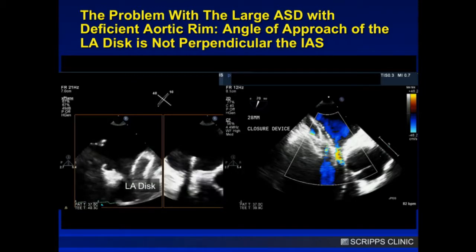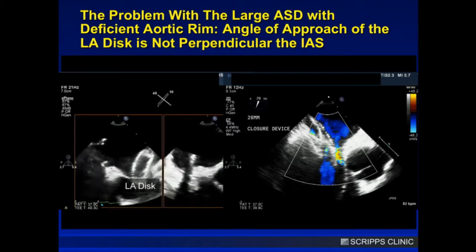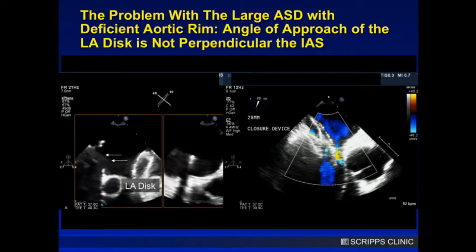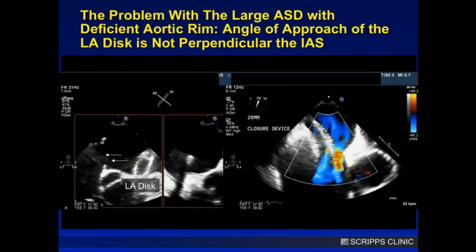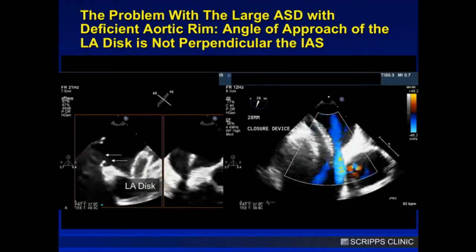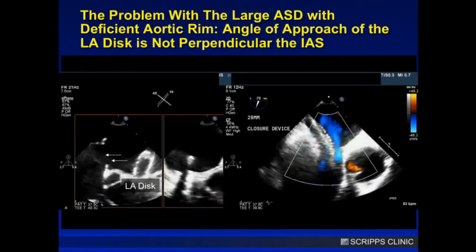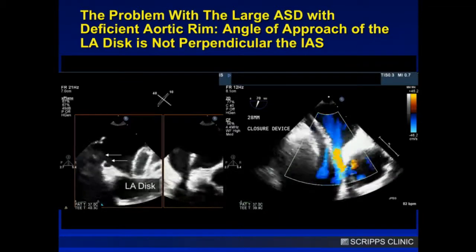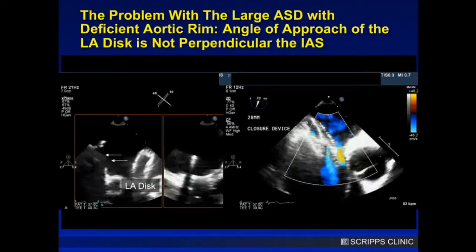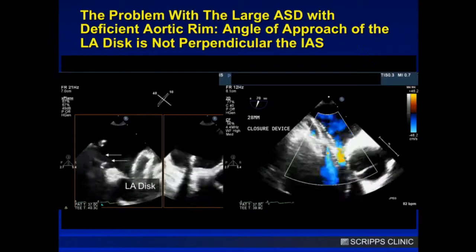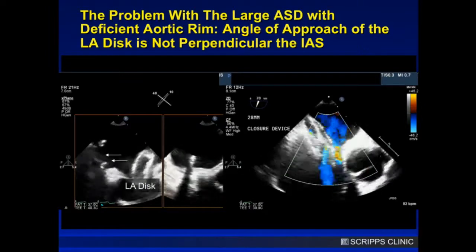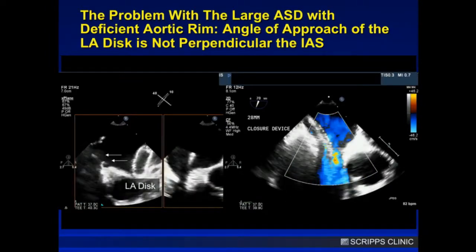The challenge from a technical, practical perspective is the angle of delivery of the discs in relationship to the inter-atrial septum. On the left panel you can see the arrows pointing towards the inter-atrial septum, with the left atrial disc open. As you pull that back, it will just slide through because the angles are not right — I'm parallel to the septum, not orthogonal to the septum. And you can see in the same case, as I pulled back and deployed the right disc, I've clearly fallen to the right side. This was TEE-guided in this particular case.